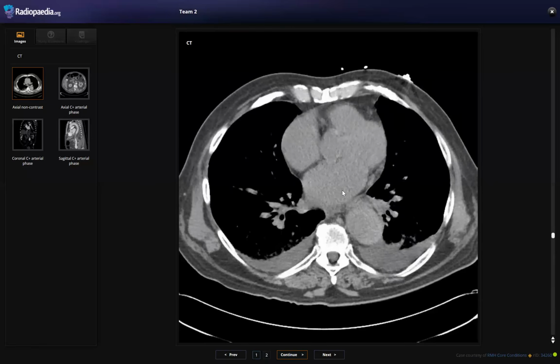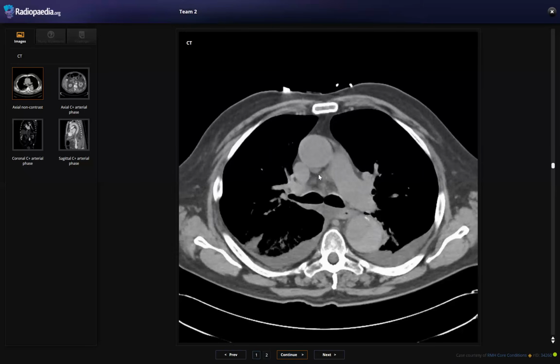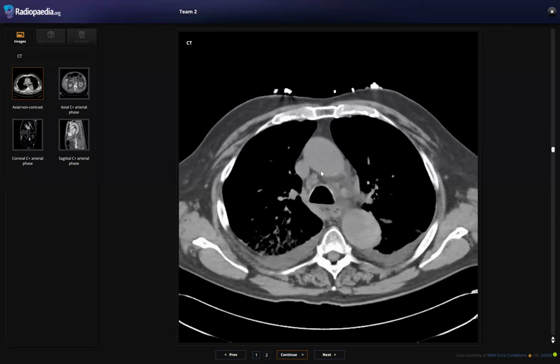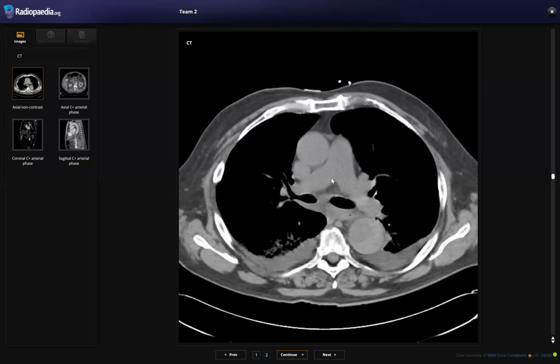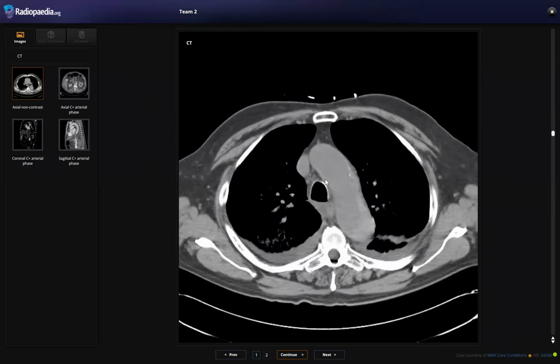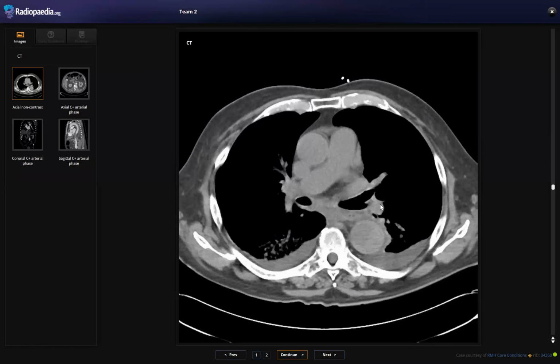Also, when you are provided with a CT pulmonary angiogram, CTPA, you must also take a look at the aorta. Sometimes it is a perfectly done and well-timed CTPA, so the aorta is nulling, but it shows intramural hematoma. So take care of such cases. You must look at all. Don't only be minded with the PE, even if the clinician is also suspecting PE. You must be thinking again of aortic pathology. Okay. Well done.